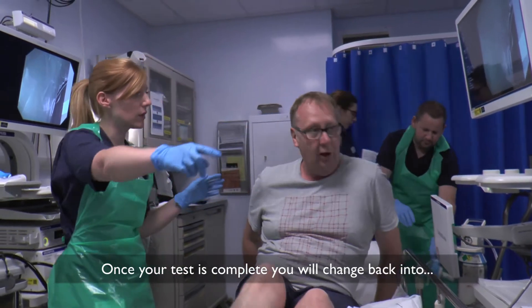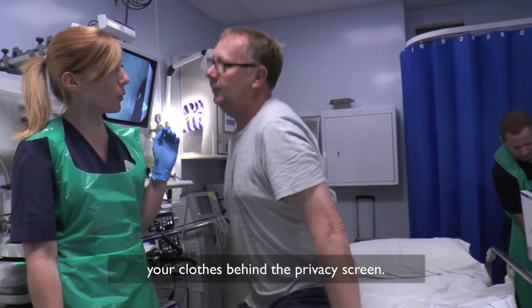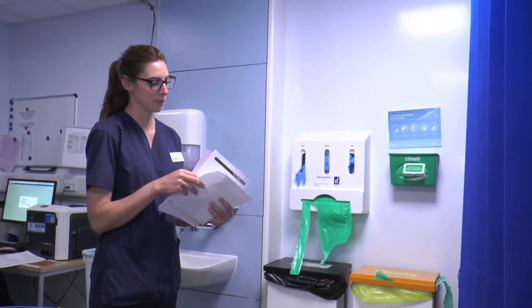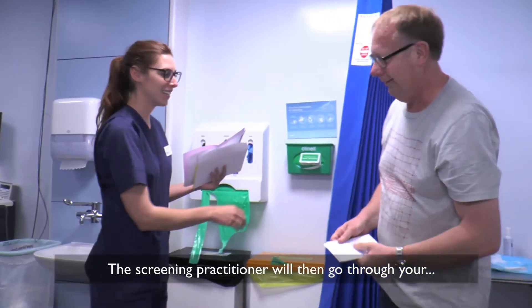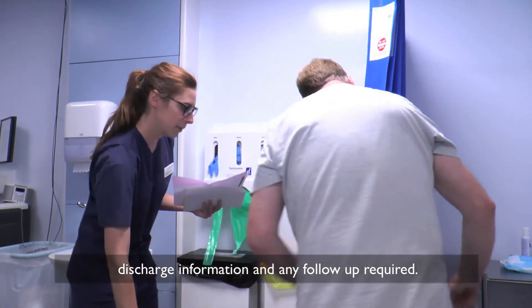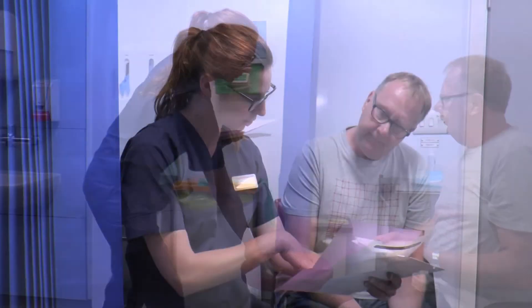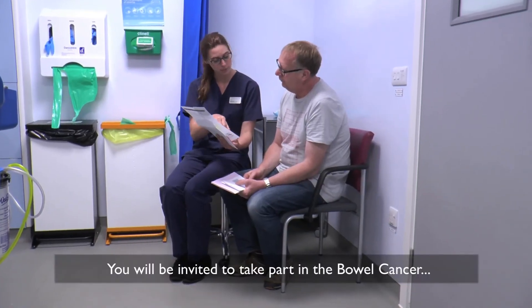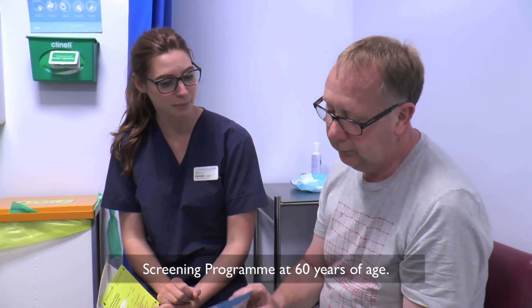Once your test is complete, you will change back into your clothes behind the privacy screen. The screening practitioner will then go through your discharge information and any follow-up required, showing you where the camera has been and where it has looked. You will be invited to take part in the bowel cancer screening programme at age 60.